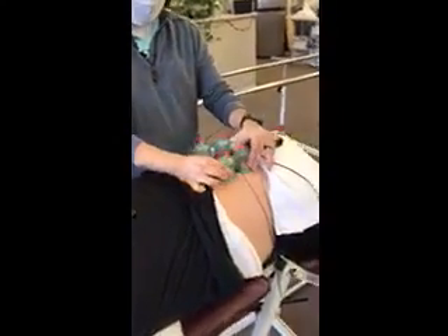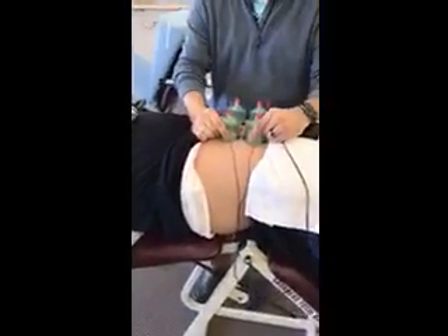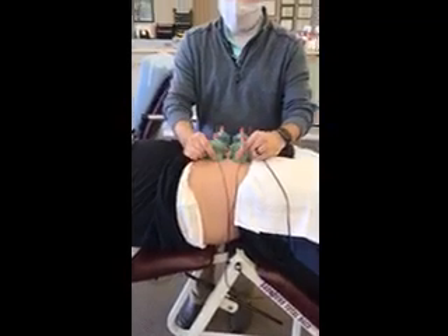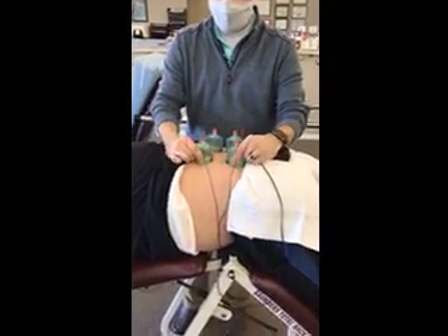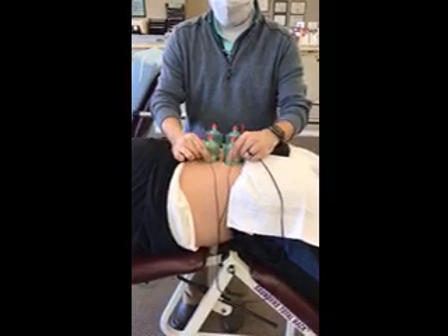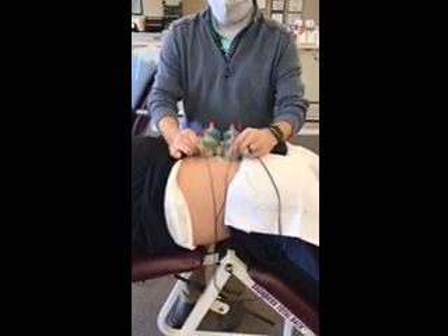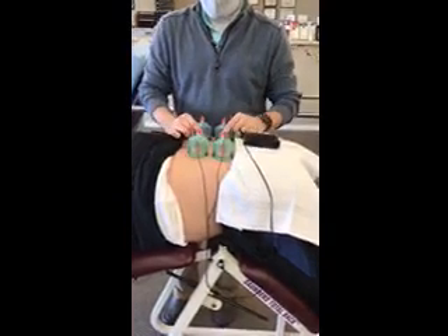What I do is just kind of turn it to the patient's comfort, and then pull up on the tissue, get a good release. You can move them apart, move them back and forth, but when I pull up like this, that seems to be where you get the greatest tissue release.